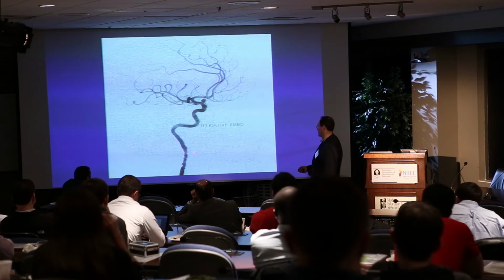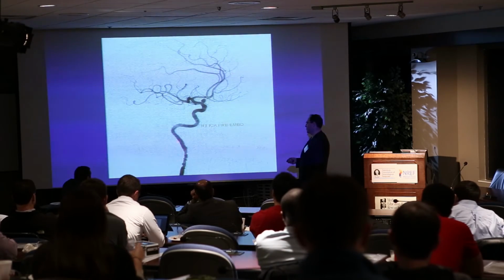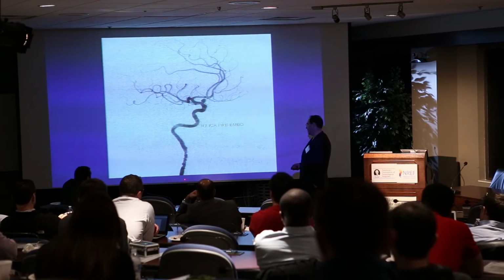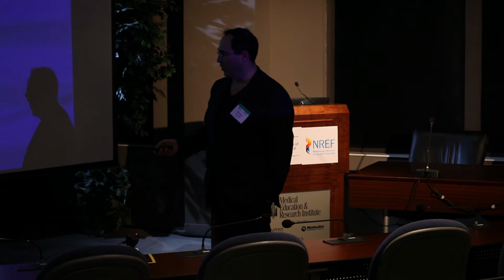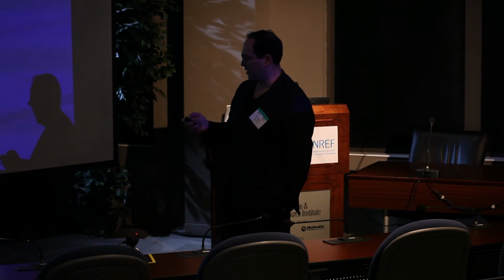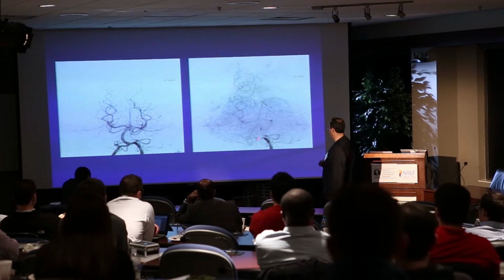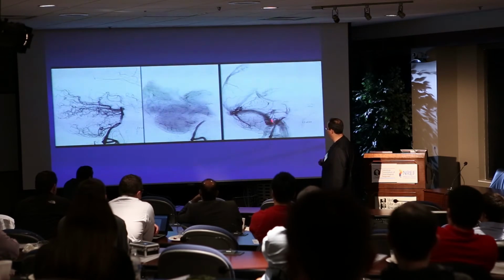Again, so here, pre-embo, you can see this patient's obviously got some reactive vascularity, and so when you're putting your guiding catheters up here, you could get occlusion or stagnation of flow. One option is to put your bigger catheter down here in the common and come up with a smaller Navien or whatever type of catheter that you want to use. We have much nicer and slippery catheters and small catheters that can be very flexible and get you closer before you even have to put your microcatheter in that you can use in these kinds of situations. Here you can see a stagnant column of contrast in the vert. I don't think that's from our case. And again, contrast that's not washing out, right?